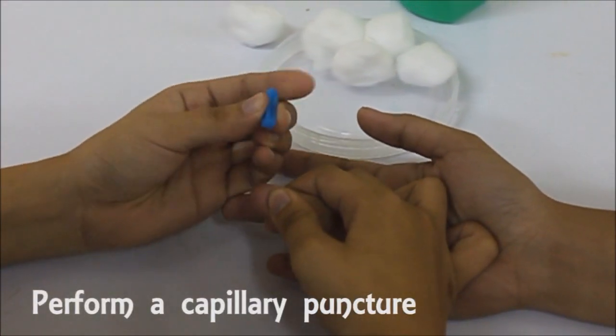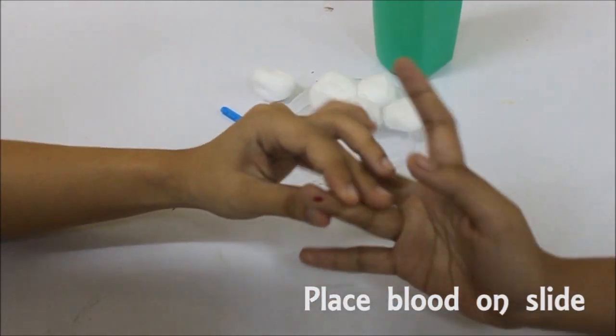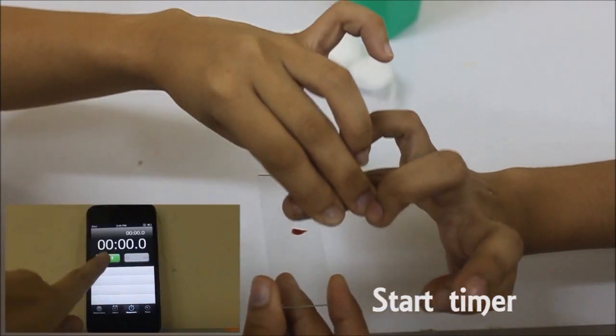First, do a capillary puncture. Place a drop of blood at the center of a clean slide and start the timer.